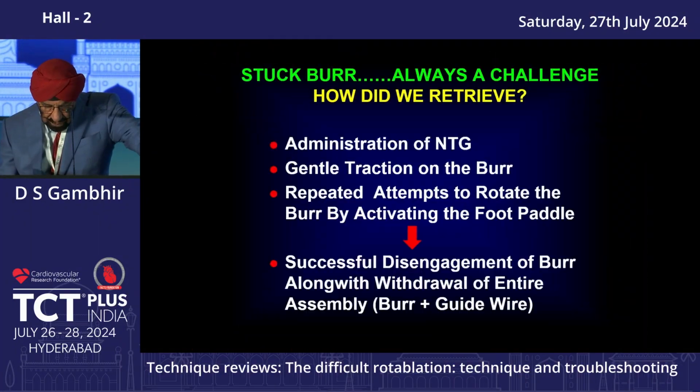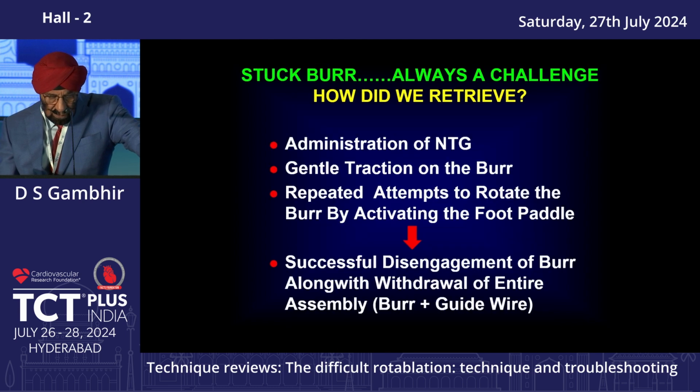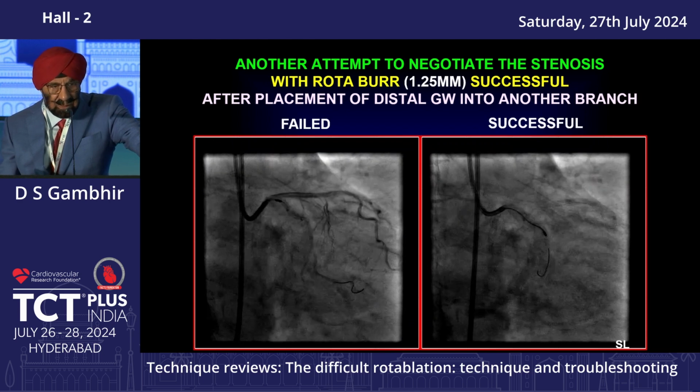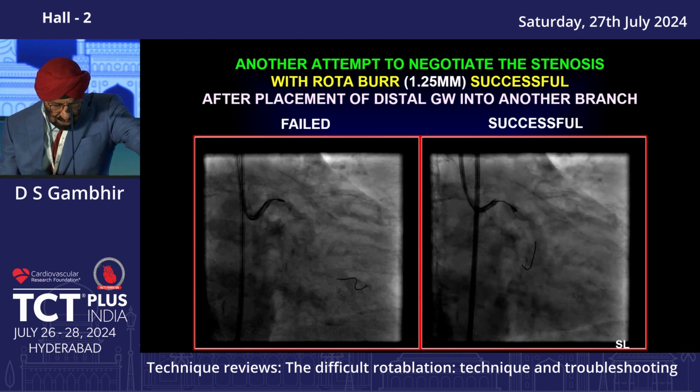So what we did was, at that time, the problem was the rota burr got stuck. So we had another problem. There was entrapment of the burr. So with the conventional administration of nitroglycerin, some gentle traction on the burr, and repeated attempts, successful disengagement was obtained. Now we took another swipe at it, and you can see the difference between these two.